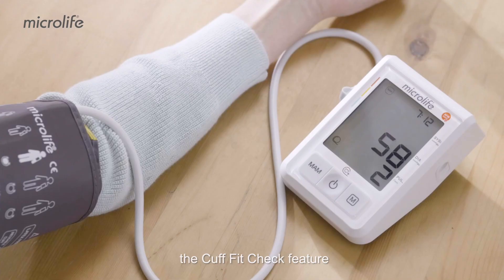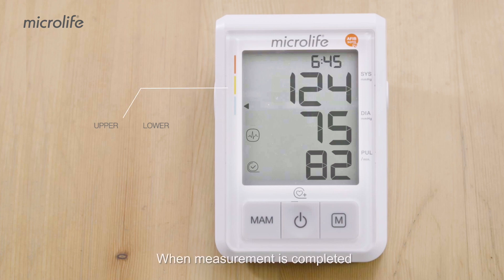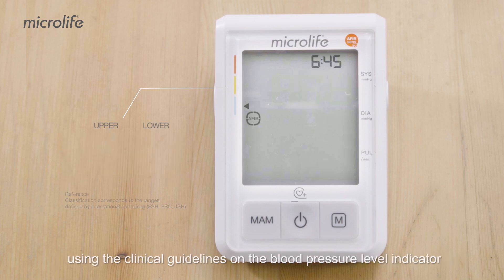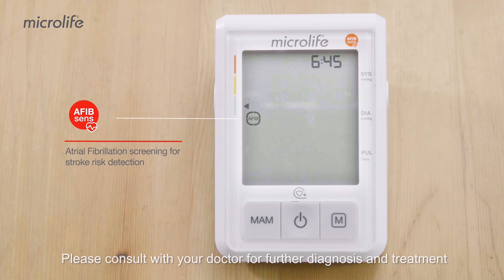During inflation, the Cuff Fit Check feature indicates whether the cuff fit is sufficiently tight or not. Refrain from talking and moving during measurement. When measurement is completed, your upper and lower pressure results will be displayed and classified using the clinical guidelines on the blood pressure level indicator. If atrial fibrillation is detected, an AFib symbol will be displayed. Please consult with your doctor for further diagnosis and treatment.